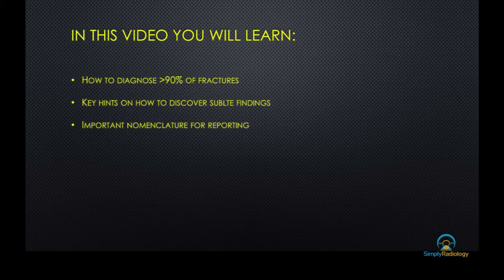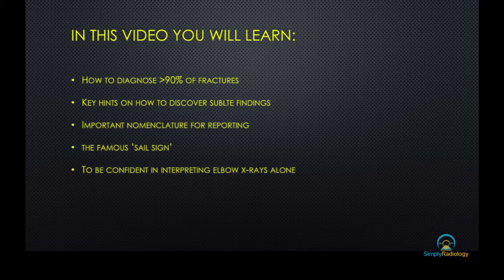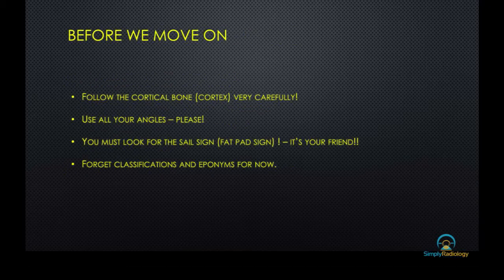More, I will tell you some important stuff that can be valuable if you're a radiologist later reporting to clinicians. I will tell you stuff about the famous sail sign. I will come to that later. And finally, my goal is to make you at least somehow confident in looking at these images and finding the pathology by yourself.